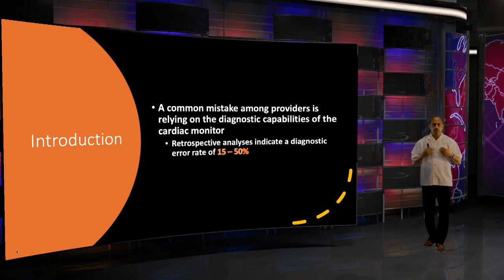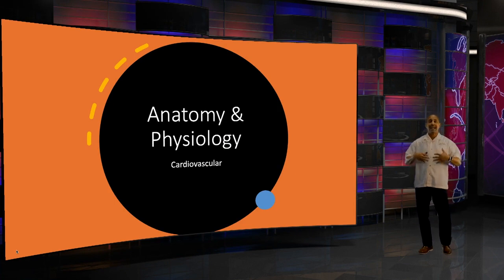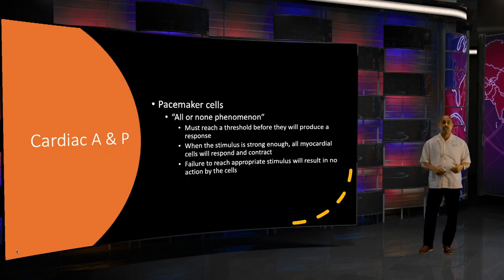So we really and truly have to be able to read these ECGs manually. What I like to say a machine is good for is to kind of raise the eyebrow, saying, oh my God, my machine is saying it's a STEMI. Well, let me dive into my ECG and look at it through kind of like a microscope to say, yes, this is a STEMI or it's not. So I want you to know there is room for error with the machine making the decision of this is a STEMI or not. All right, let's dive into the anatomy and the physiology of the cardiovascular system.